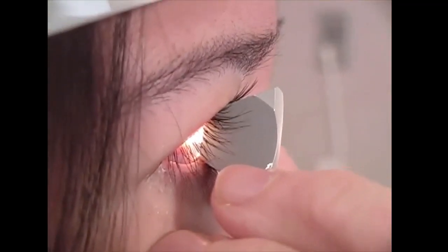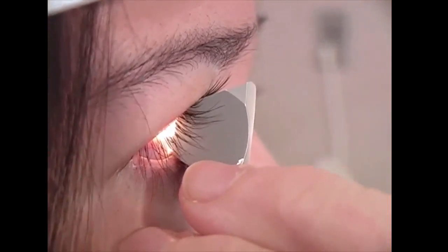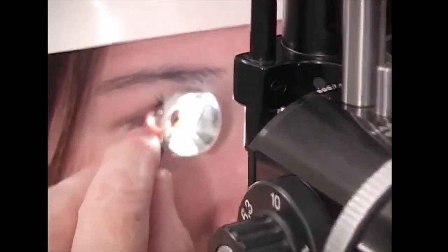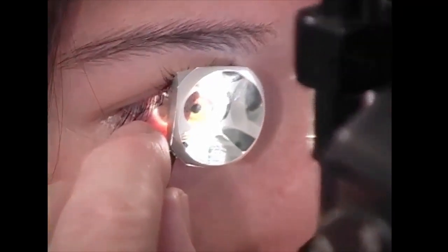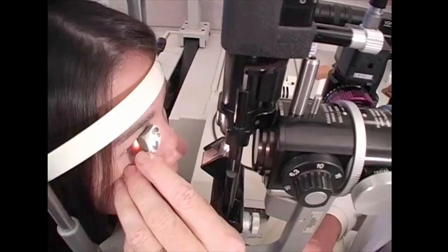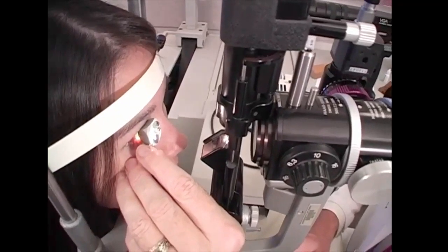So once one becomes skilled with this lens, it's pretty easy to use and pretty fast. You can see I've braced against her face, so as she moves, I can keep up. And if I want to indent, I just push on the lens. You can see corneal folds there. But indentation is a little bit beyond what we're going to talk about in this lecture, because it's a little bit more advanced.